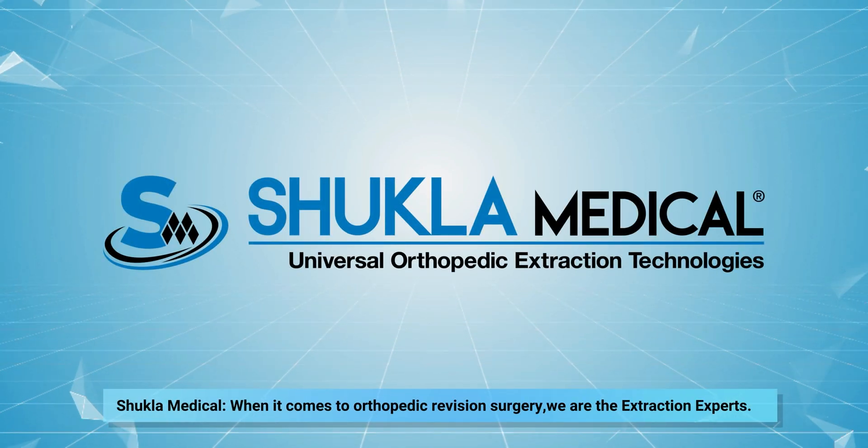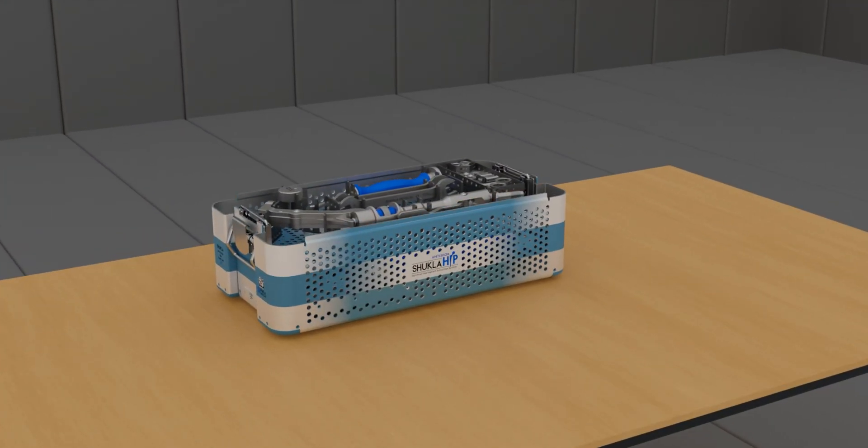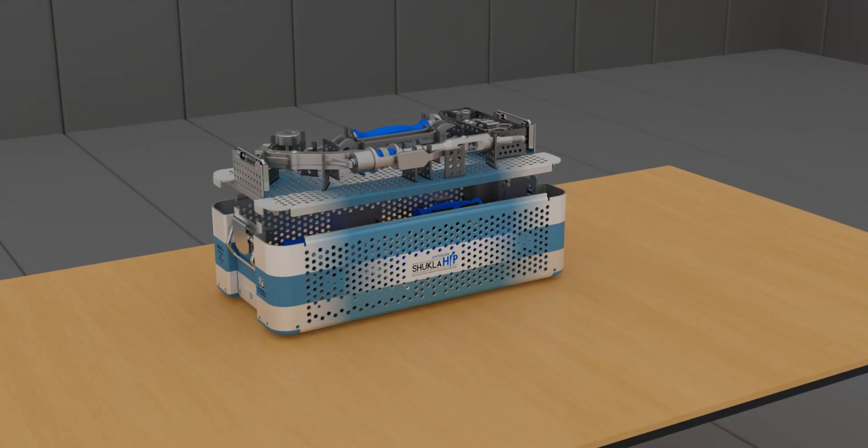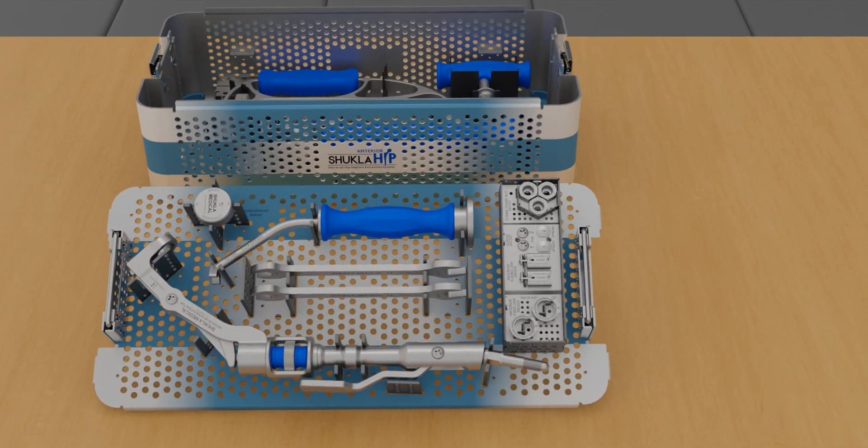Shukla Medical. When it comes to orthopedic revision surgery, we are the extraction experts. The Shukla anterior hip implant extraction system is designed for removing hip stems using the direct anterior approach during revision surgeries.